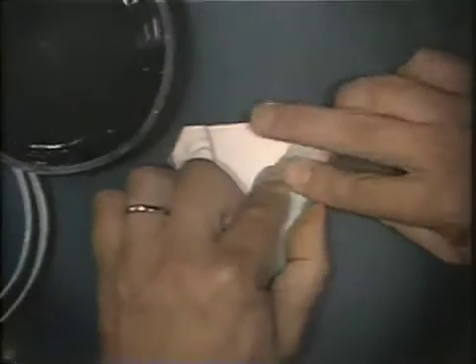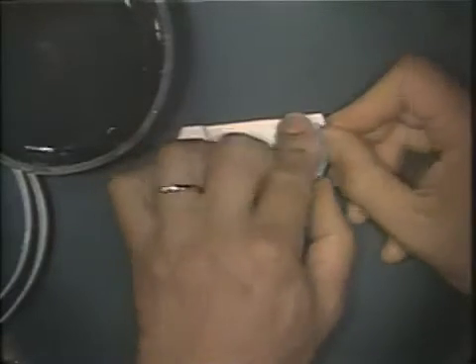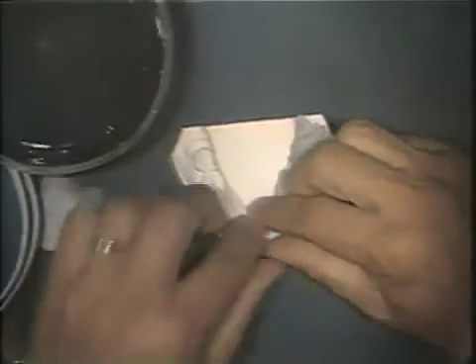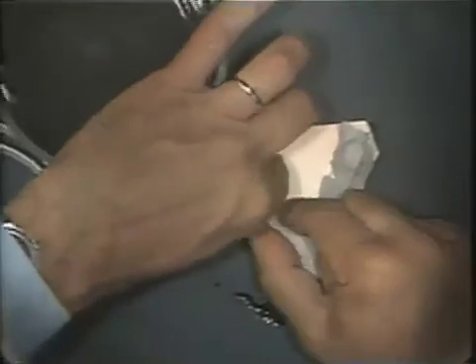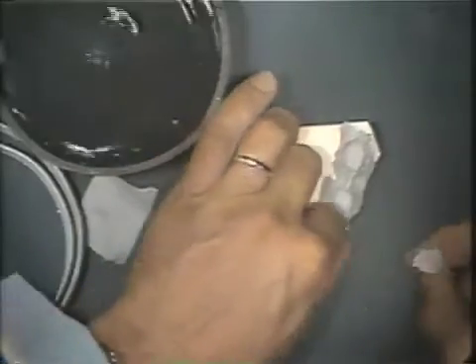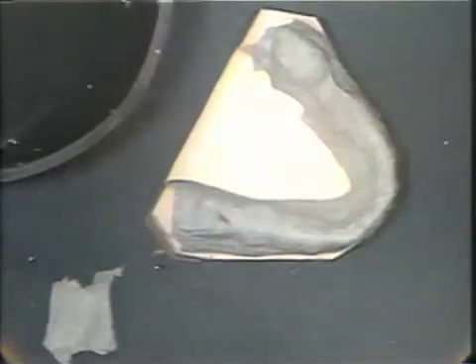Two thicknesses of wet asbestos strips are placed over the occlusal surface of the teeth. The asbestos is brought down to the penciled finish line on the study cast. An extra piece of asbestos is laid over the abutment teeth. It is important that the asbestos be placed down into the edentulous area.